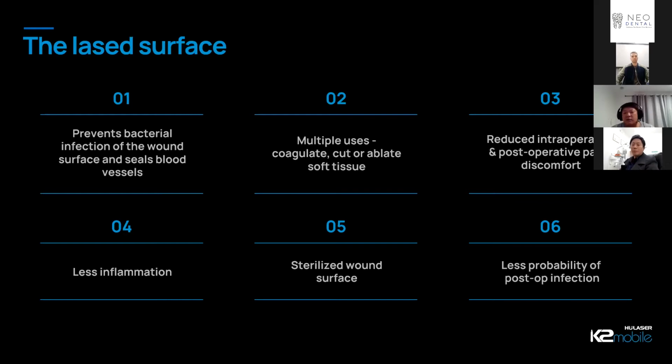And overall, I guess this is a bit of a debatable point, but it promotes reduced surgery time as well. But you could argue someone who's not very surgically capable with a laser will be much slower than someone who's very capable with a blade. So take that with a pinch of salt.